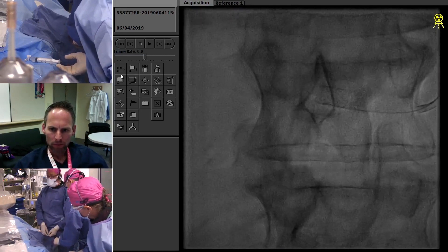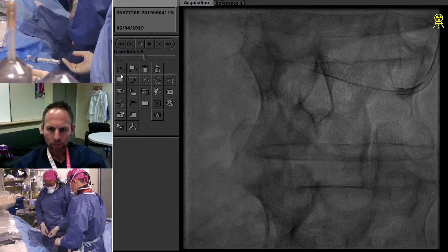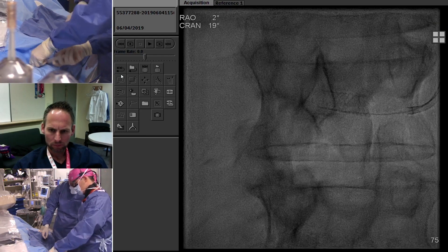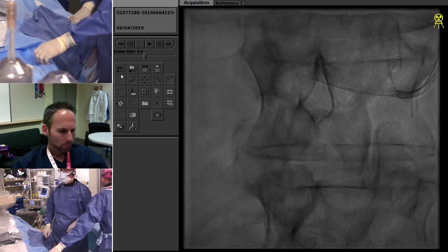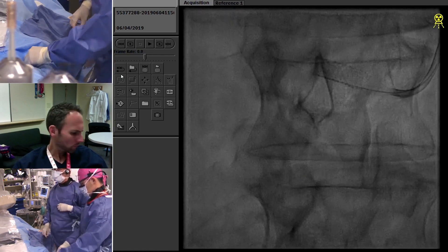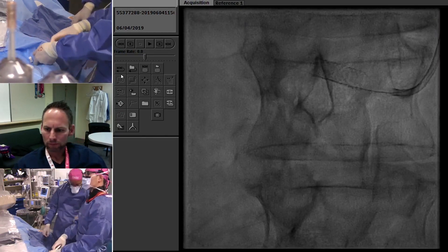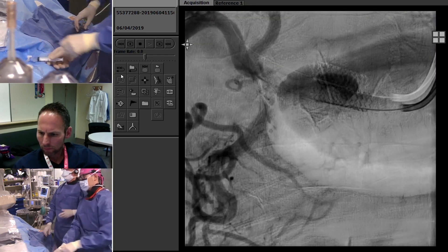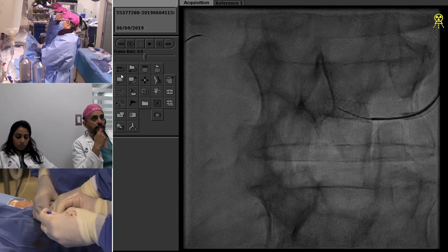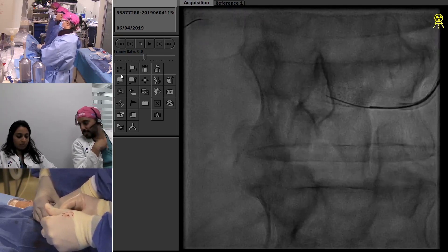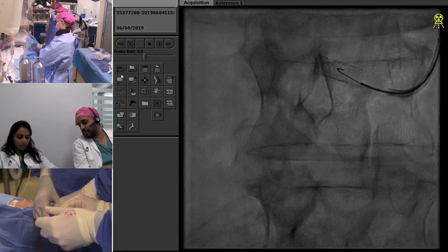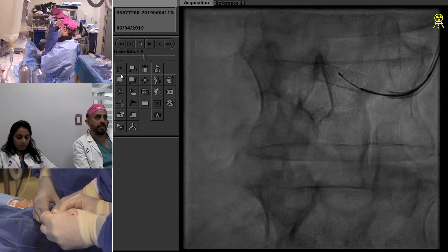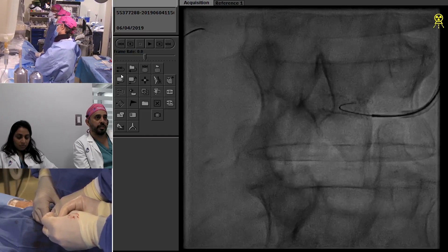After deploying the stent, I pop out to check landing — it looks exactly as hoped. The stent is a coronary product, not a peripheral product, so it won't be easily available from your peripheral rep — it's in a coronary catalog. Regarding the Terumo 119 slender sheath: I've used it and find both approaches comparable. I've become comfortable with guiding catheters over the years, particularly for renal and visceral stents. Getting this selective with a sheath would probably be more work.